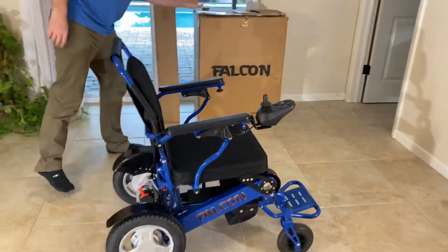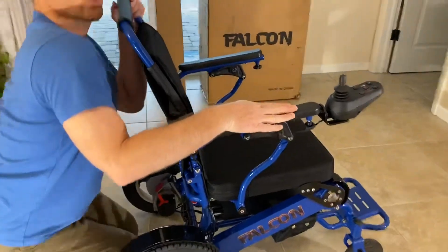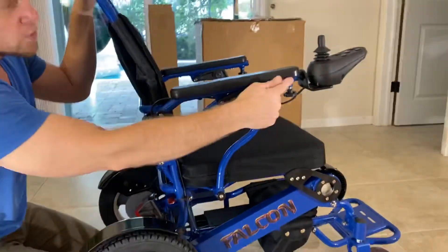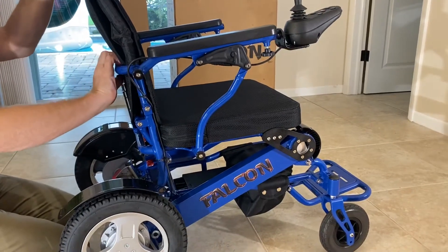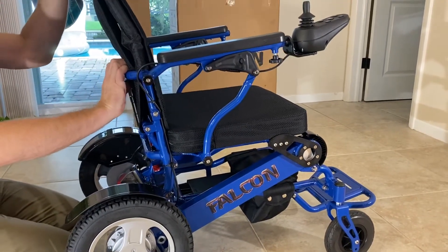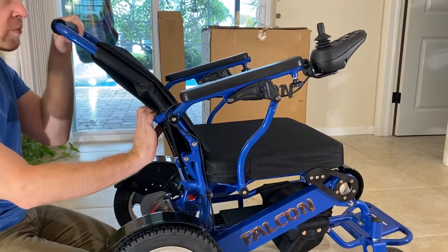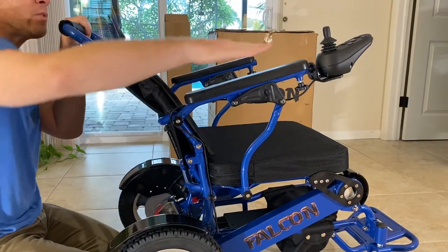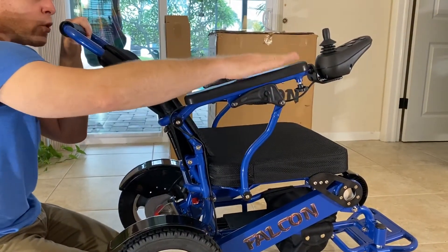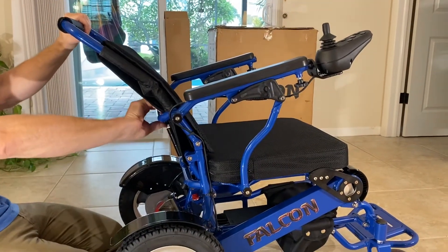Looking at just the side view before I show the mechanics: this is the only chair that is ergonomic in this specific fashion. As the reclining part goes back, the actual armrests lift, reducing additional strain on the shoulders. It's an ergonomically correct chair, especially with the headrest.